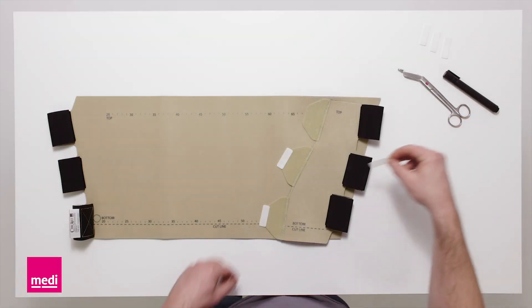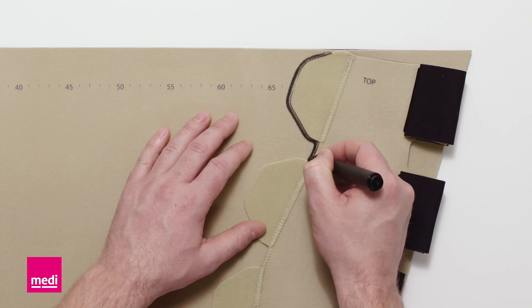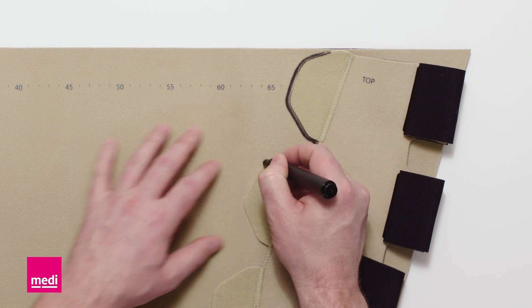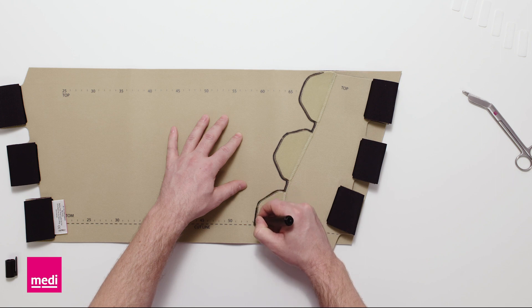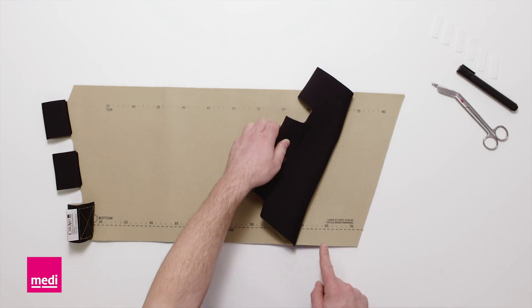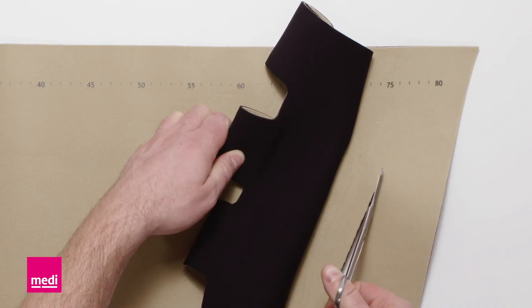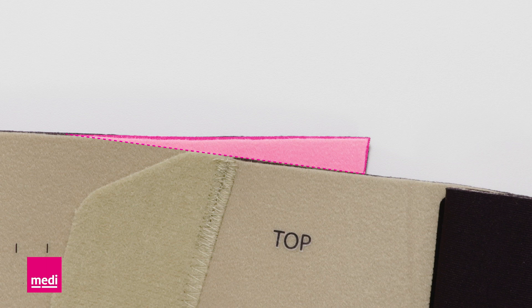You can fix the small component additionally with the white hook fasteners provided. Alternatively, mark the position to quickly restore it in case of accidental detachment. Cut off excess material leaving approximately 5 cm of overlap. Excess material can be cut off.